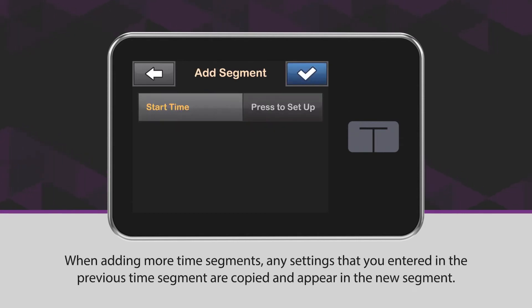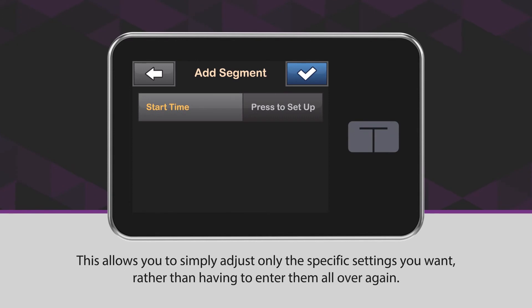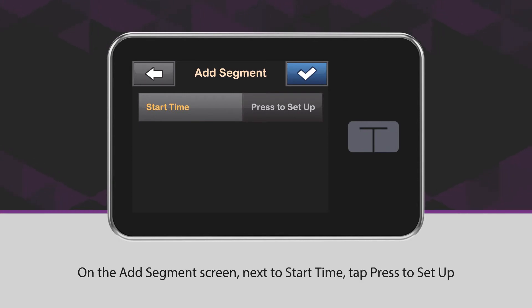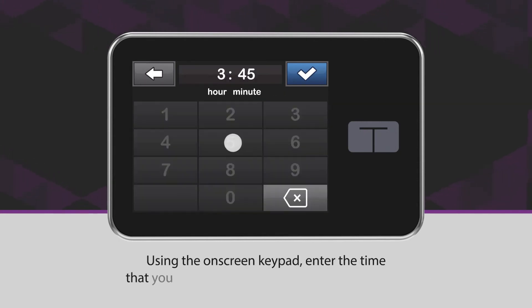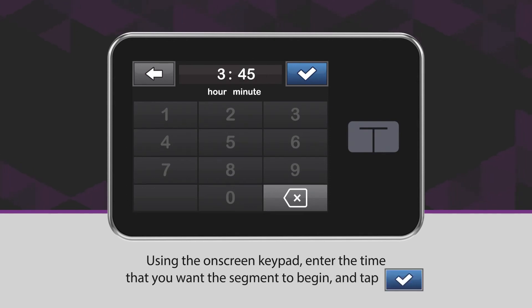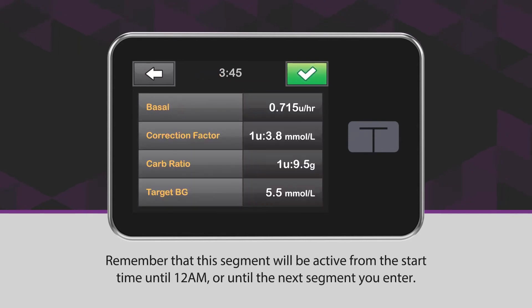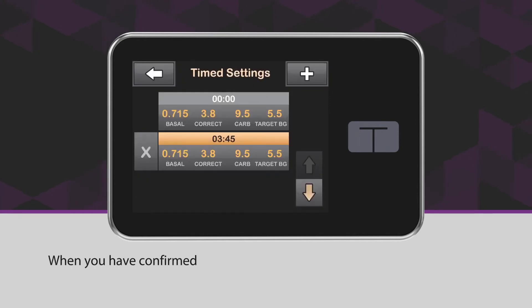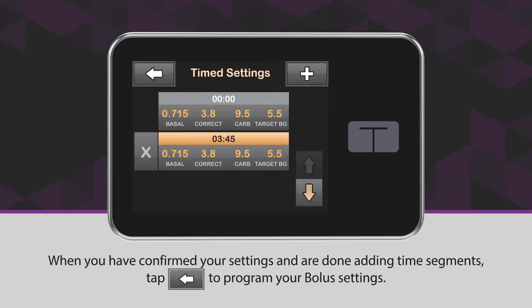When adding more time segments, any settings that you entered in the previous time segment are copied and appear in the new segment. This allows you to simply adjust only the specific settings you want, rather than having to enter them all over again. On the Add Segment screen, next to Start Time, tap Press to Set Up. Using the on-screen keypad, enter the time that you want the segment to begin and tap the blue checkmark icon. Remember that this segment will be active from the start time until 12 a.m. or until the next segment you enter. When you have confirmed your settings and are done adding time segments, tap the back arrow icon to program your bolus settings.